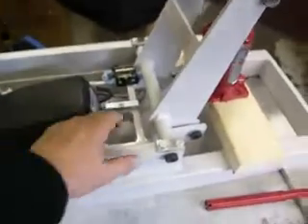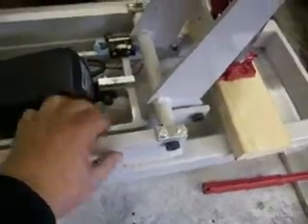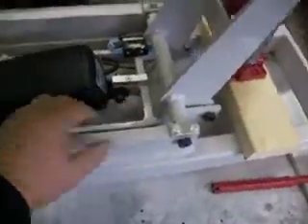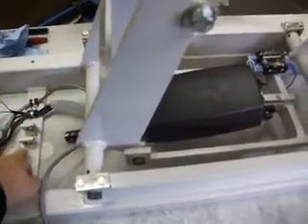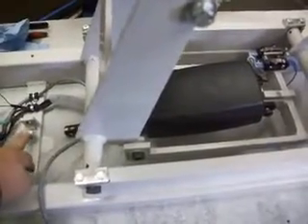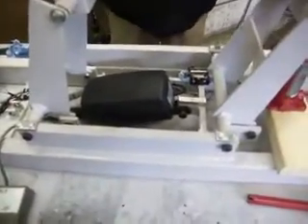At that point, since the mount here has been broken, it's not connected at this point, we'll then begin our removal process here, and then following the next instructional video, the complete removal process and reinstallation process will be provided.